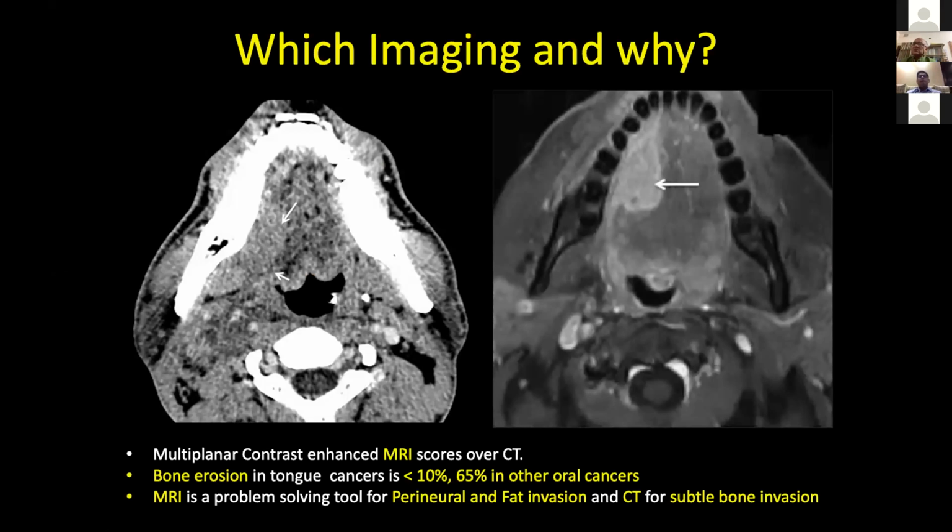Thank you. Yeah. So it's very important to understand that if you're dealing with soft tissue structures, you need MR imaging. And if you are more inclined towards understanding of the bone, that is the mandible cortex, then you need CT imaging. So predominantly for buccal CA, people who are chewing gutka, they have retromolar trigone malignancies or they have buccal malignancies. The chances of mandible getting involved is upwards of 65%. And in such situations, you need an MDCT of the buccal cavity.